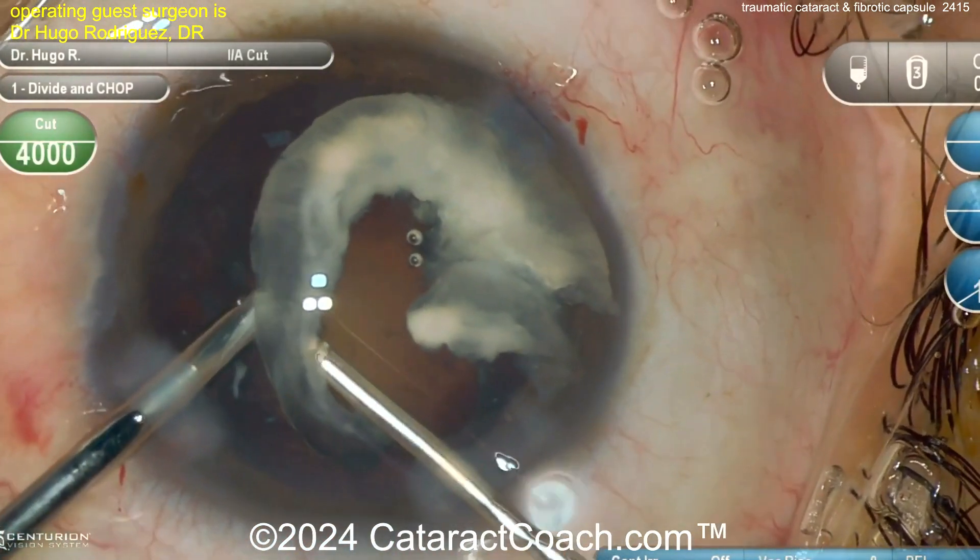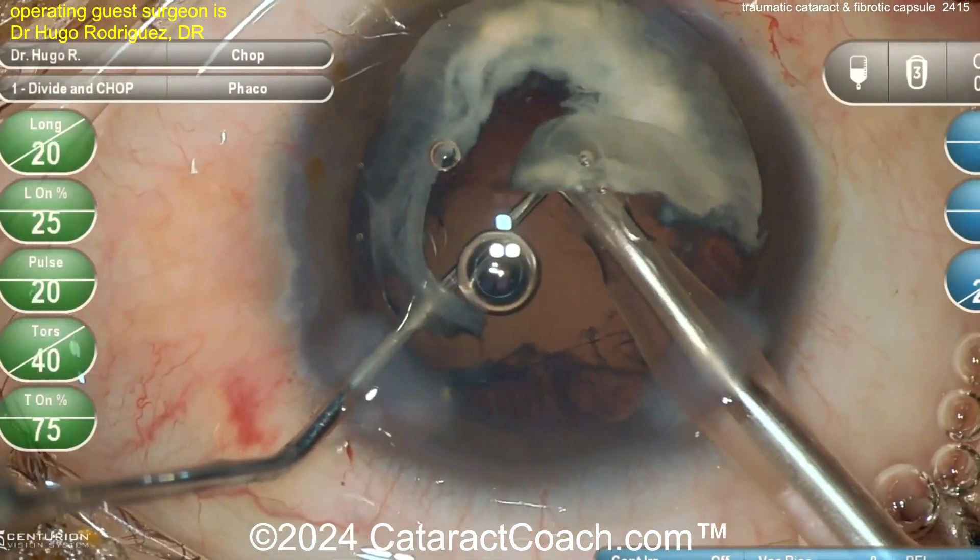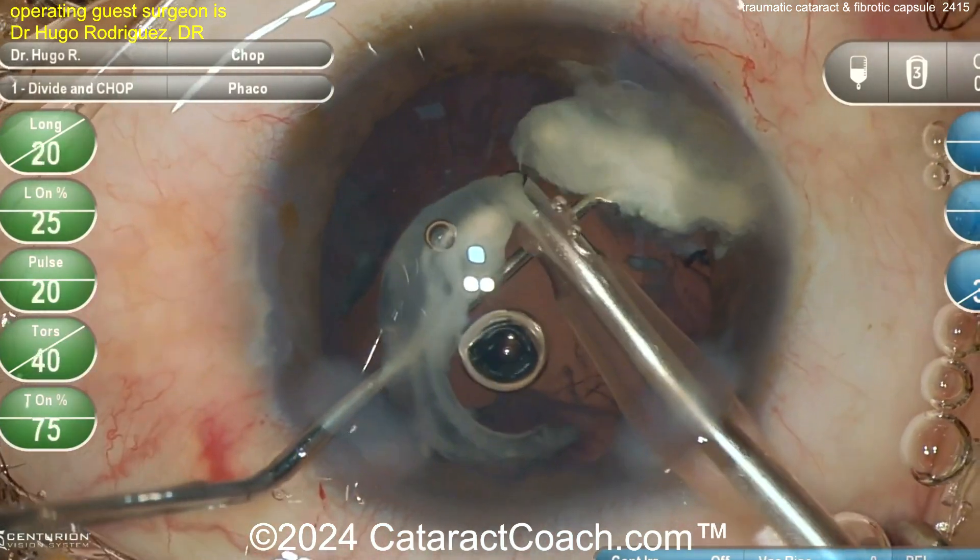Now going in here to emulsify it, again using the vitrector to clean this out. Hopefully you have an intact posterior capsule and you can get some sort of three-piece lens in here with some sort of stability.